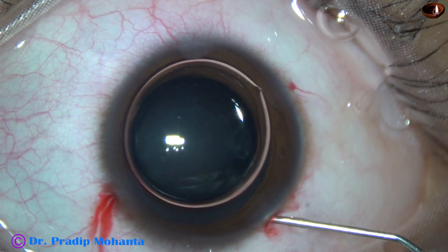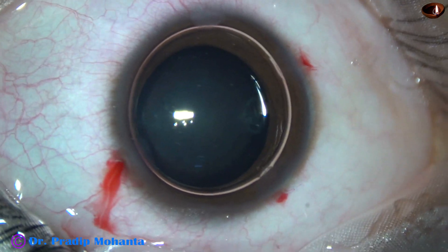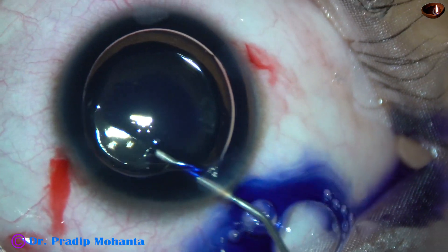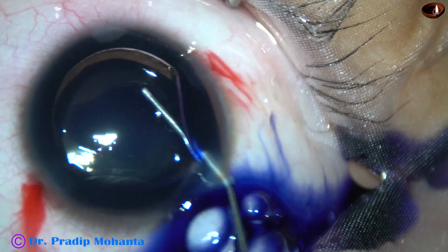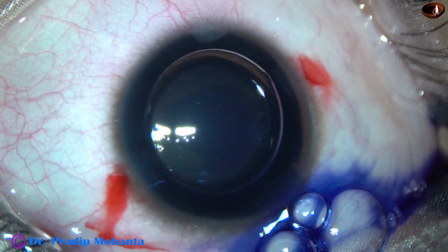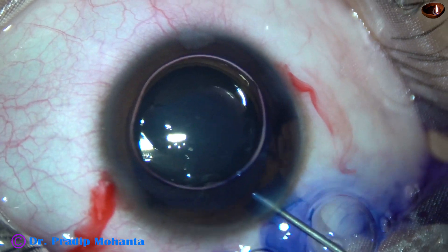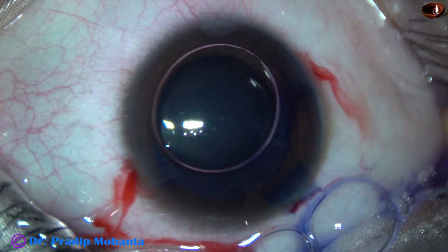Our seniors have taught us that we should always put sutures to the main wound and to the side ports in case of pediatric cataracts. It is not so. If we make the incisions in this way, there is no need to put any suture.